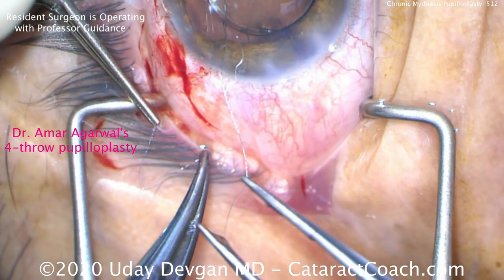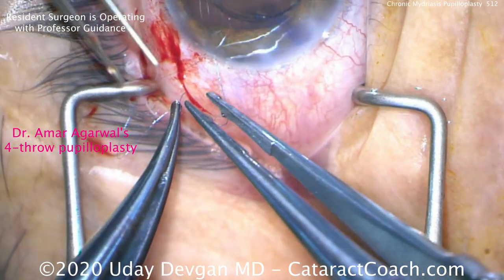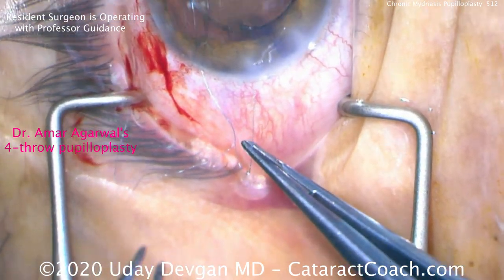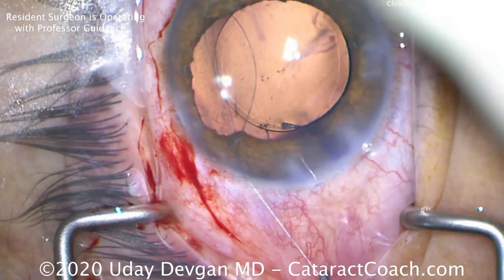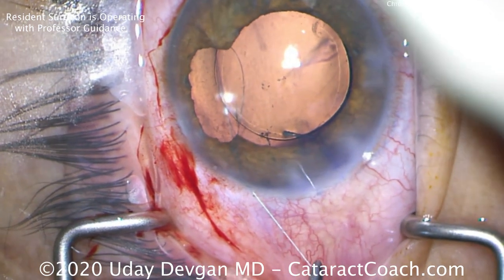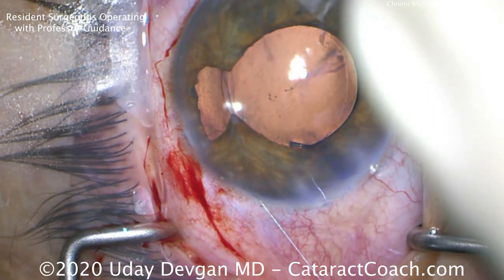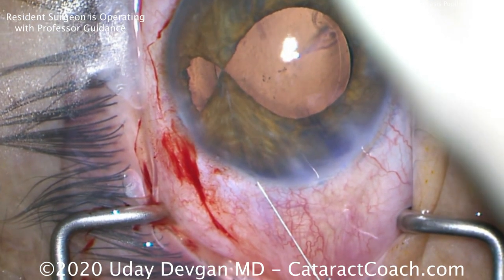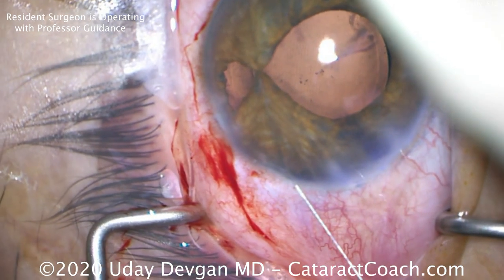So again, grabbing that suture end, we pulled it through four loops. Now you simply grab each end and pull the knot back into the eye. Holding that suture temporally, and now nasally — as we pull these two ends, watch how the four-throw knot goes inside the eye and comes together, taking your time, nice, slow, and deliberate. And we can bring the iris together just like that. By having four throws, the knot stays in place.